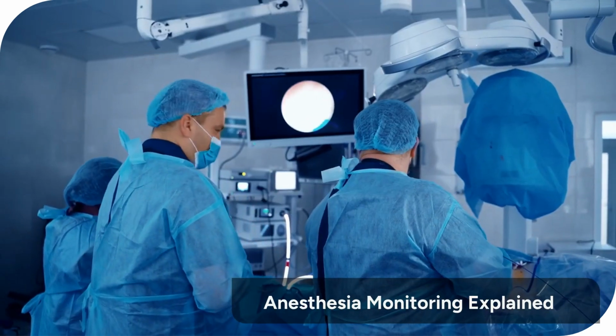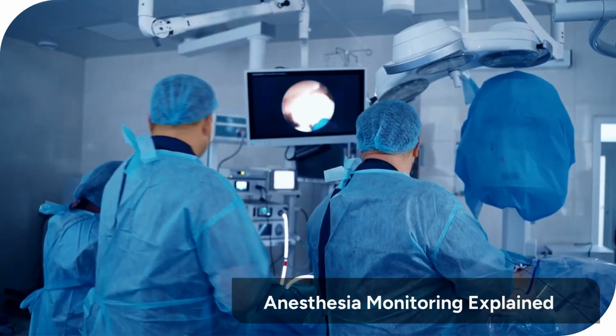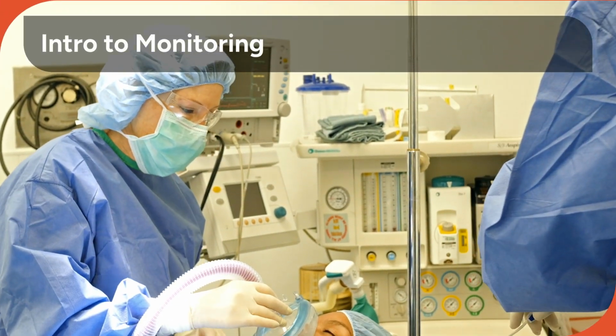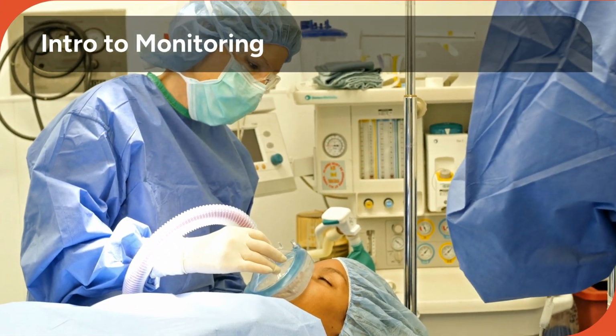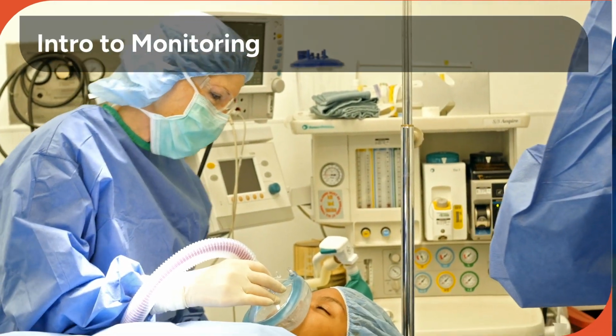Have you ever wondered how doctors ensure you stay completely asleep during surgery? This is where anesthesia awareness monitoring comes in. Anesthesia awareness, while rare, is a serious concern. It's when a patient becomes conscious during general anesthesia and can recall events.